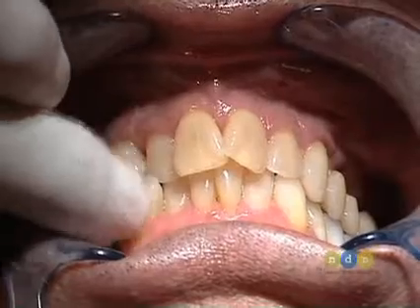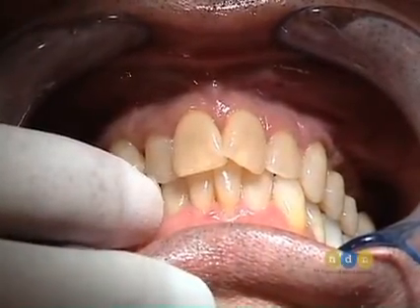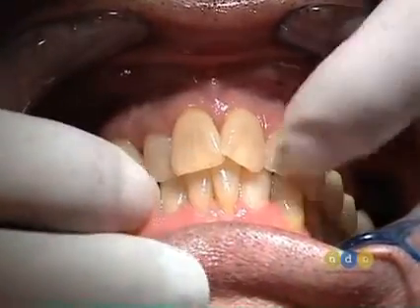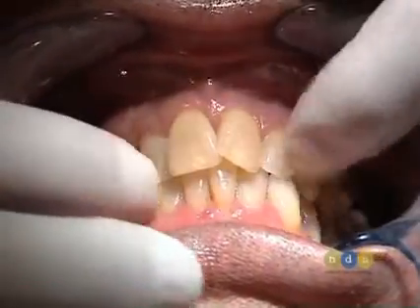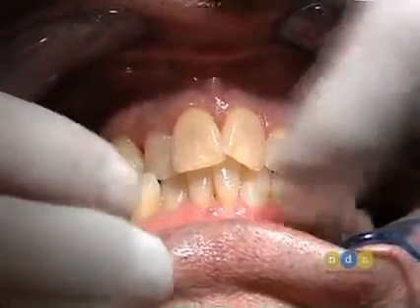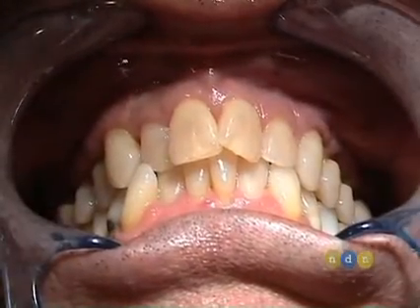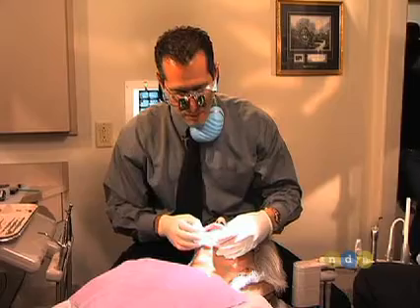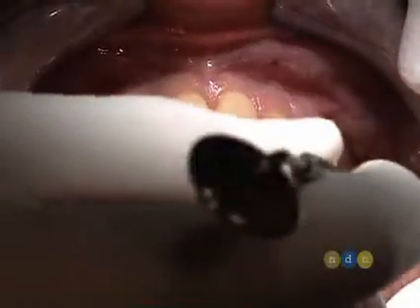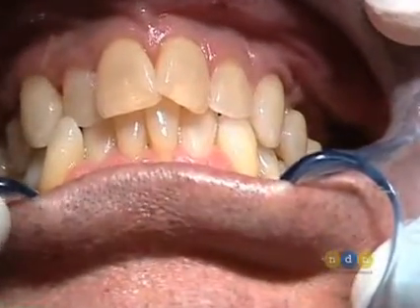As part of the treatment, I will actually be preparing this tooth and bringing it in. Later, we will actually be restoring the lower arch, so we're not going to worry about that too much right now. We will create an ideal upper arch form, and later when the lower is restored, we will actually have an ideal upper arch to make the lower to perfect the occlusion. You can see if you look in the posterior segments, we have some porcelain fused to metal crowns in the molars that we will be replacing.